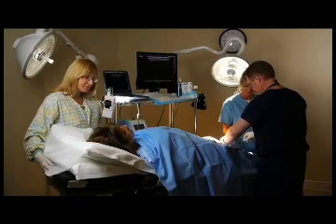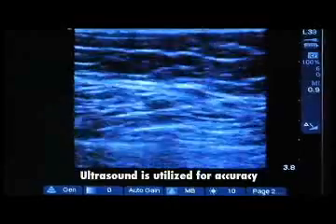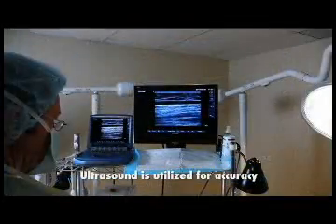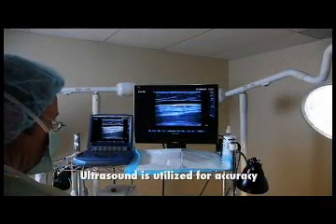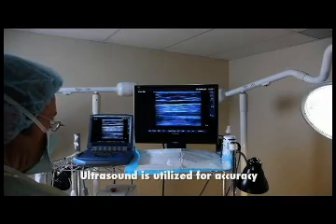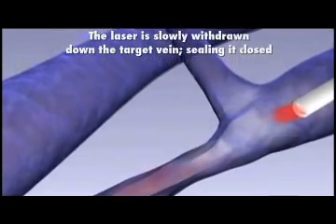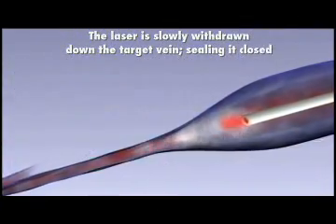That's the reason we're able to do the procedure in the office and why it's so much more convenient for the patients as well as safe. EVLA involves the insertion of a very fine laser fiber into the vein that supplies the problematic surface veins. Ultrasound guidance is utilized during the procedure so that the laser fiber is placed accurately. Once the fiber is positioned, local anesthesia is instilled around the vein to be treated. The laser is then fired and slowly withdrawn down the target vein, thereby sealing it closed.